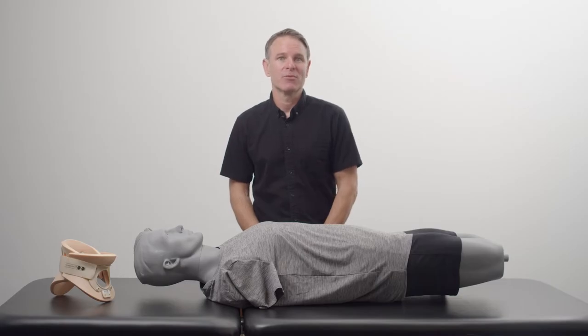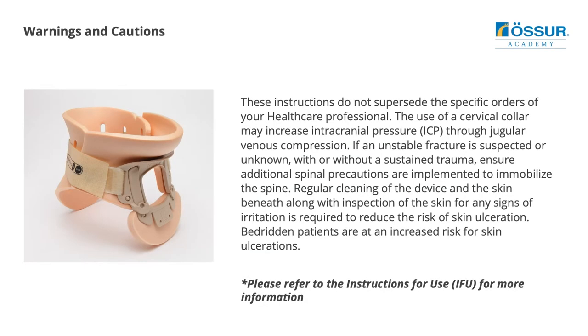This demonstration will be performed with the patient in the supine position. Please note, instructions do not supersede hospital protocols and or direct orders of the patient's position. Always follow all hospital C-spine precautions.